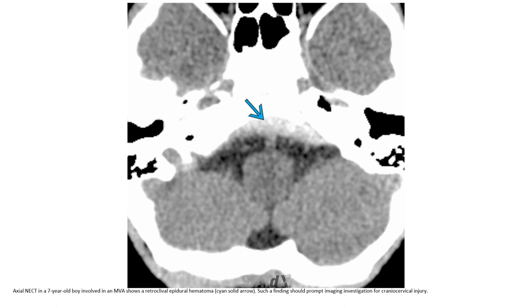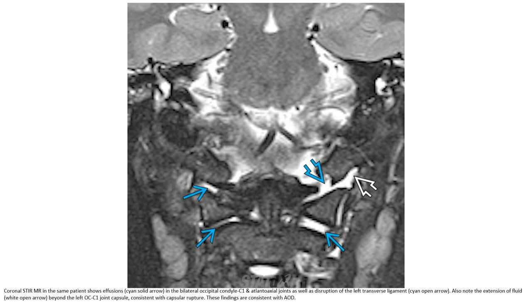This is a non-contrast CT in a 7-year-old boy involved in a motor vehicle accident, showing a retroclivus epidural hematoma — a finding that should prompt imaging investigation for cranial cervical injury. MRI in the same patient shows effusion in the bilateral occipital condylar and atlanto-axial joints, disruption of the ligamentous structures, and extension of fluid beyond the atlanto-occipital joint capsule, consistent with capsular rupture and AOD.